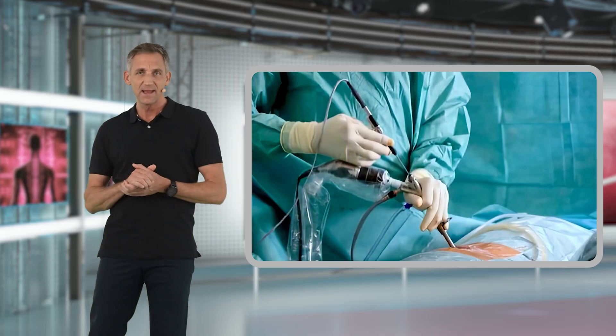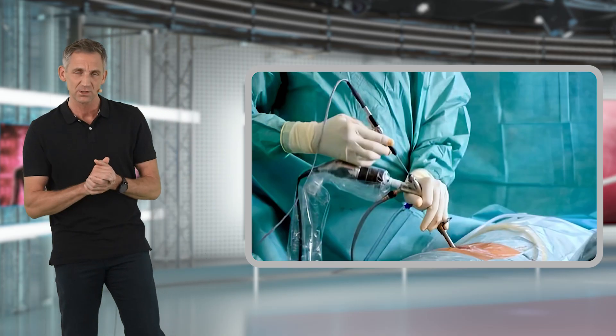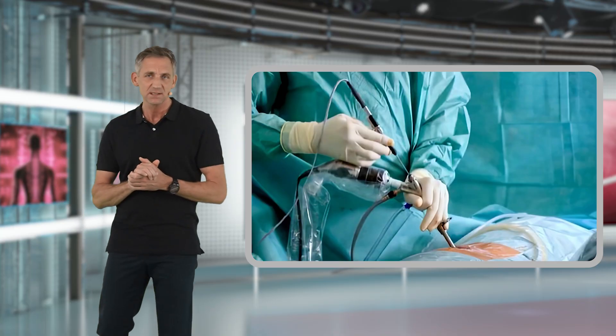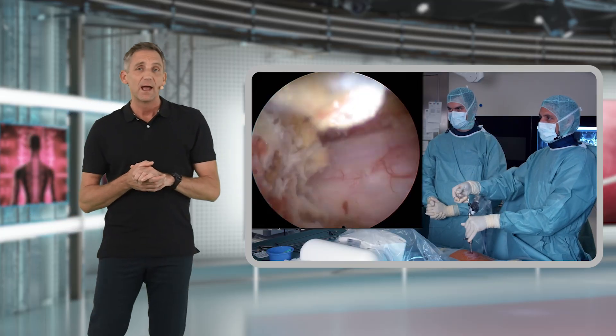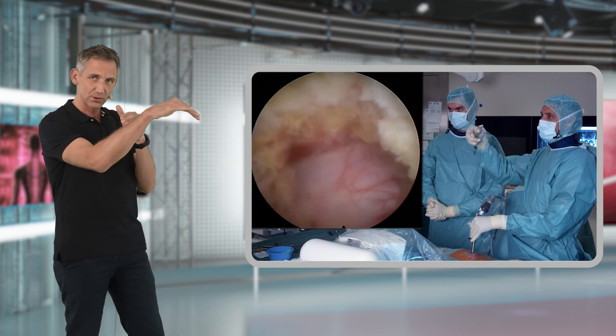Once that is done, we start to go over the top to the contralateral side, which with a little experience is fairly easy to do. You simply tilt the endoscope and start going to the contralateral side, getting a view over the top into the contralateral recess.